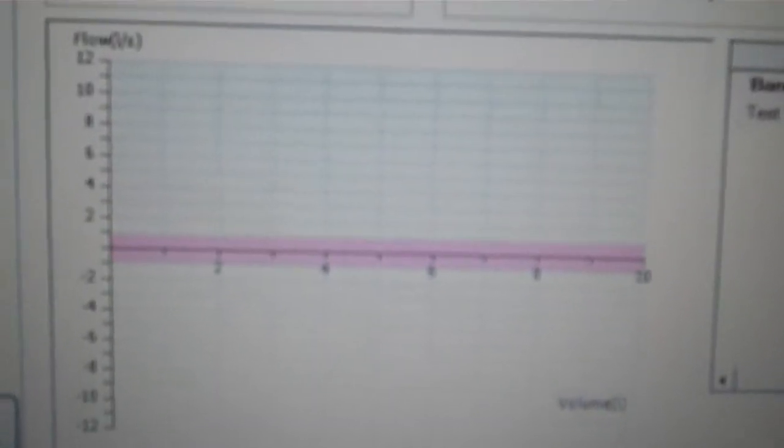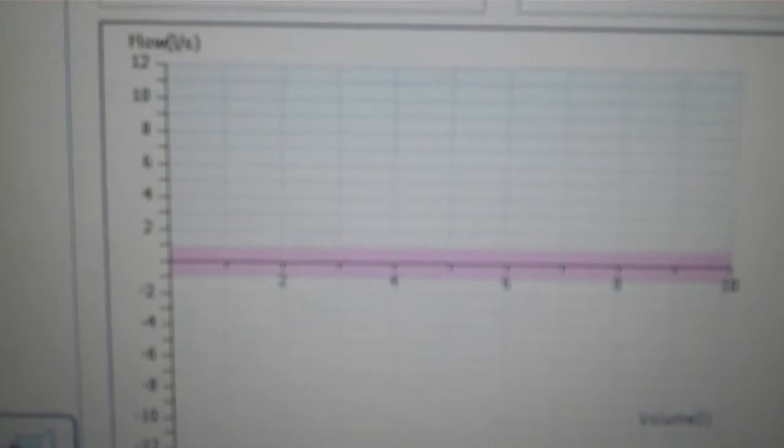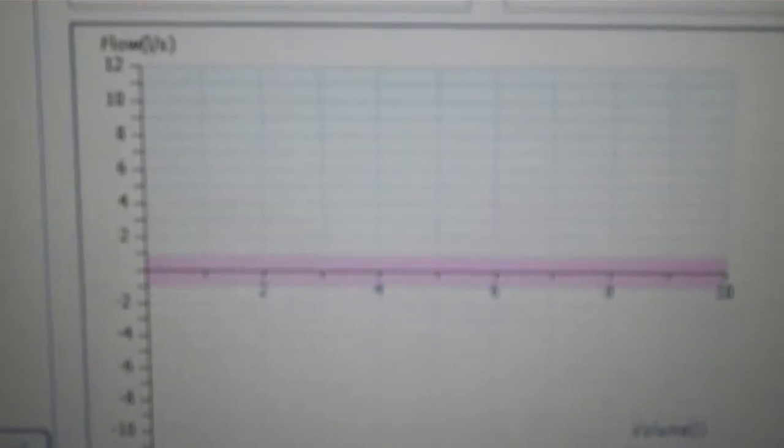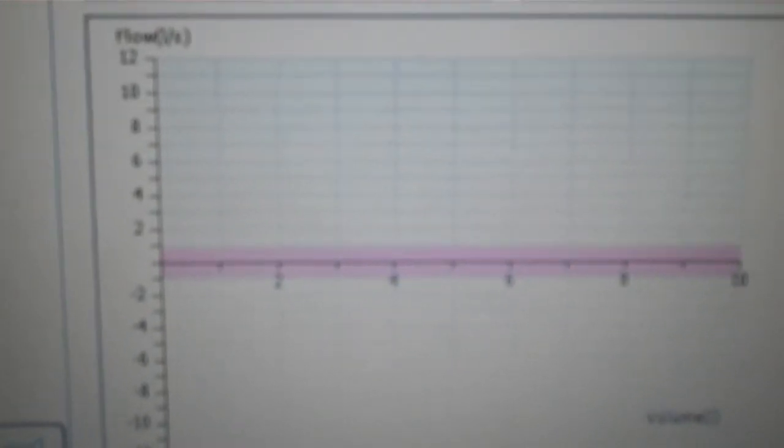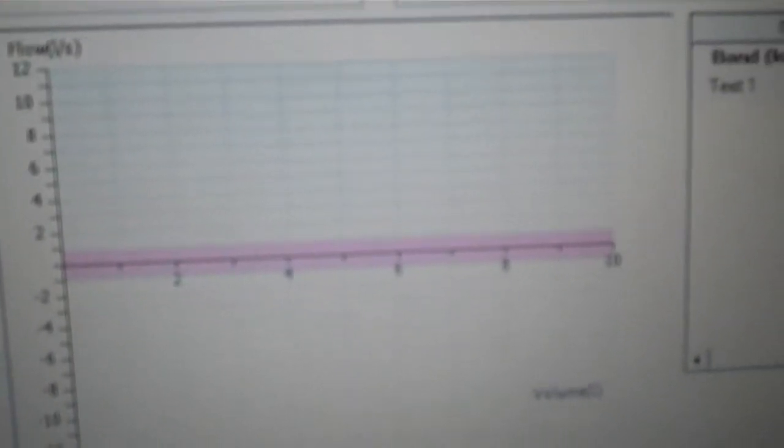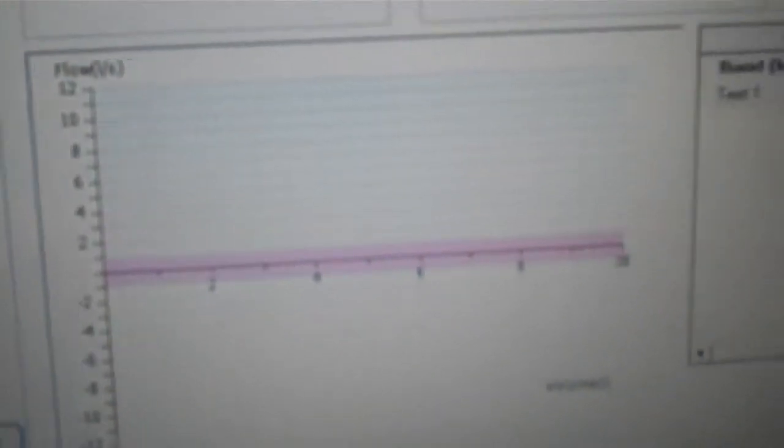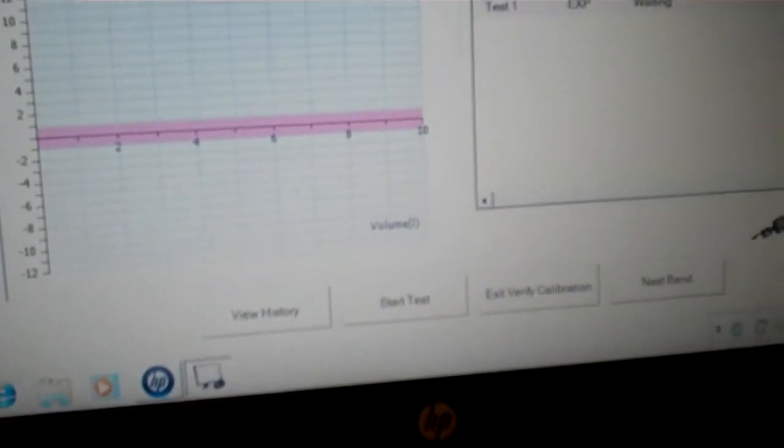You will notice here that we have a pink band. This is the low flow band, and that is between 0 liters per second to 0.9 liters per second. I will pull the syringe all the way out after I hit start test.